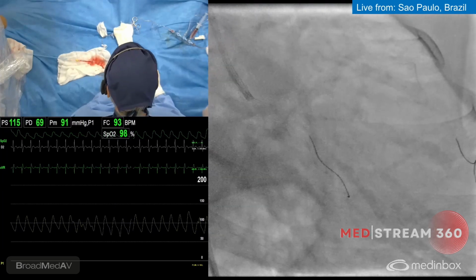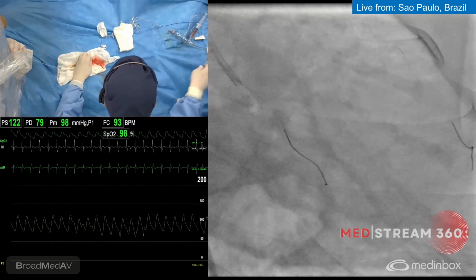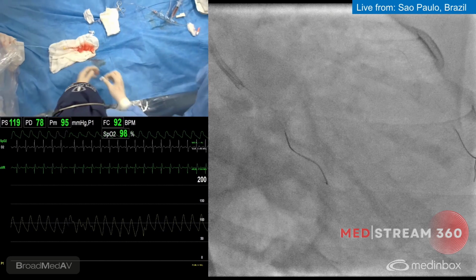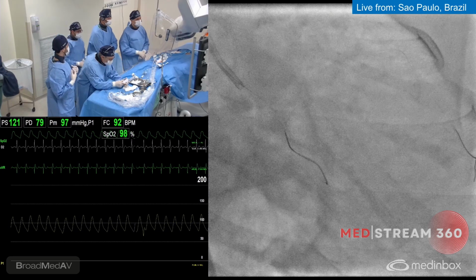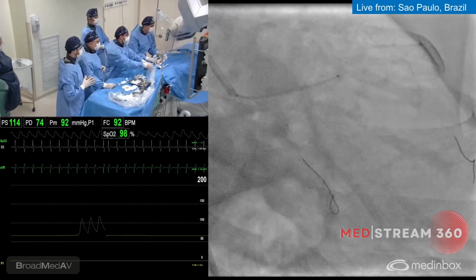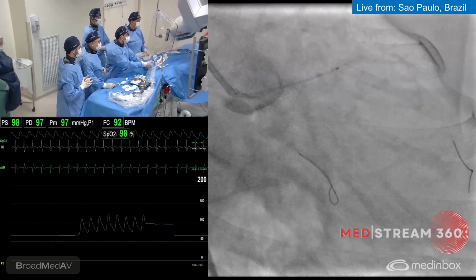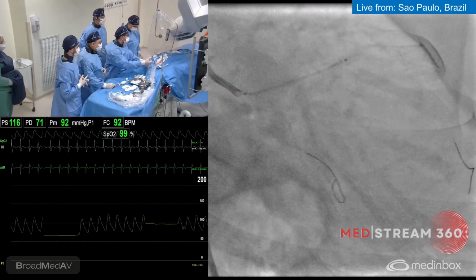So if stenting the circ is not the plan, what technique are you gonna choose? It's provisional, so stenting, then optimize, do the POT, and then recross, do the kissing. Very gentle implantation. If you do not get a good result in circ, you're gonna do a T, T and protrusion, or TAP? Yeah, if you need, yes, you do a TAP. What view we're gonna use to deploy the stent in the ostium? We use this view to check your position, but to deploy, if you want to pick the ostium, you need to use the LAO cranial view.